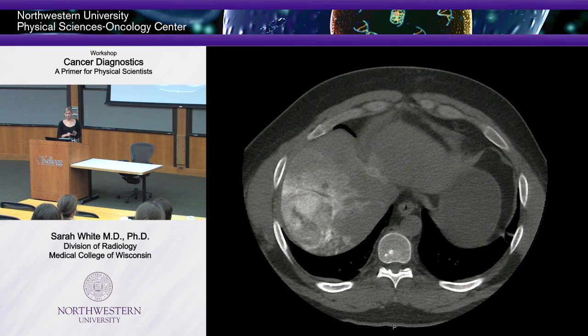So this is what it looks like after. We're back to that CT scan. Now does anyone see anything abnormal? Right, there's a bunch of oil. Okay, all that white stuff is me. I injected all of that stuff in.